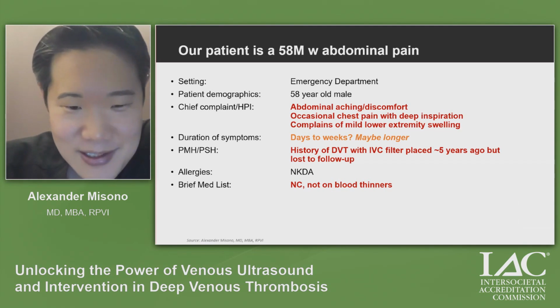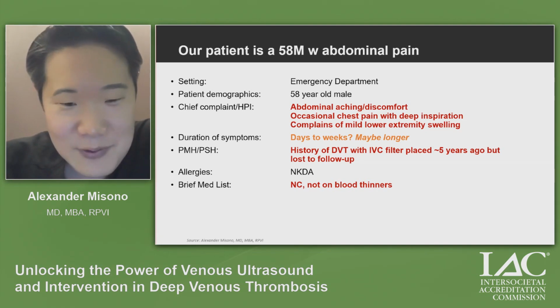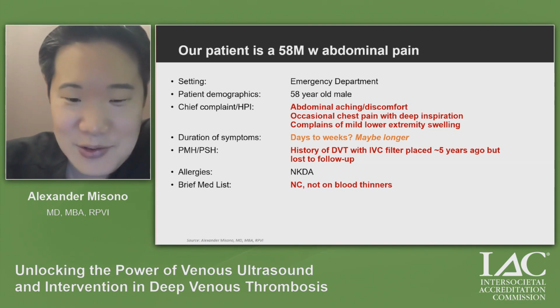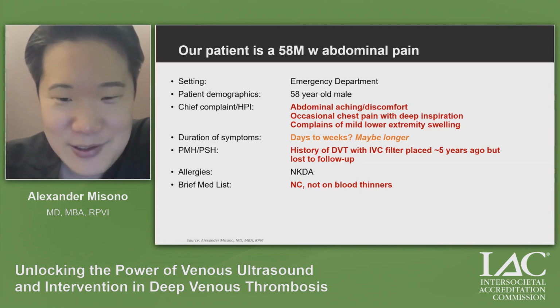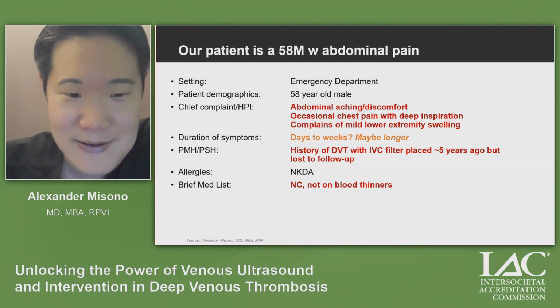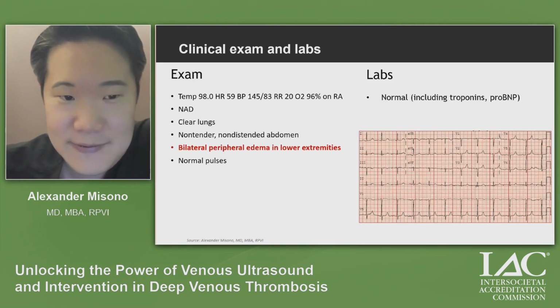He's not really sure. He has an IVC filter. It's been in there for a while. He's not even sure when that was placed, but never had it addressed, and he's not on blood thinners. So you hear this kind of history and you go, ooh, right? Every single person on this call is like, oh, I don't know what's going on with this guy. On examination, he's got some edema in the lower extremities.